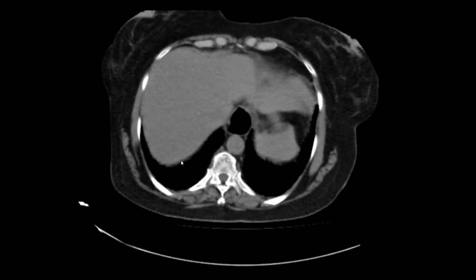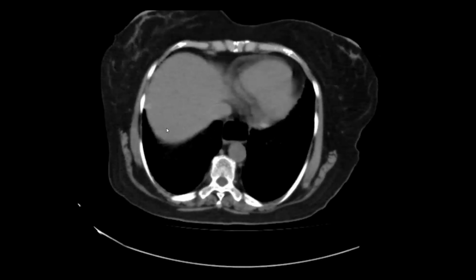Okay, and how will you manage this case? I would refer this patient to the connective tissue MDT for the discussion and the comparison of the NSIP features with the prior imaging, and further management. Okay, good. Steroids can be started. Okay, good. So that was all from my side. And you did very good in this case.